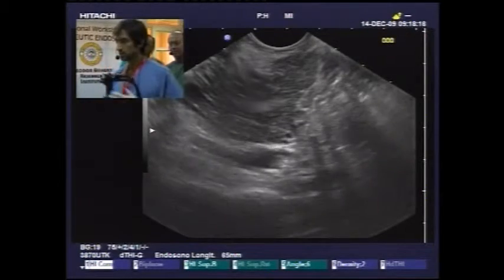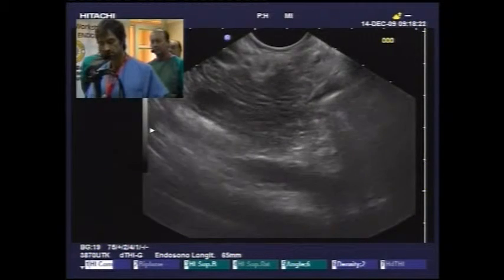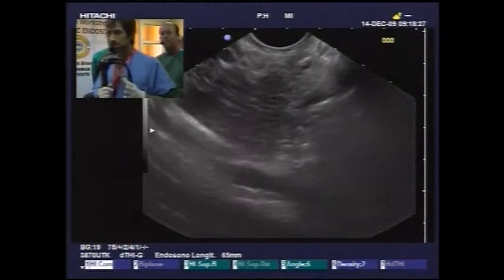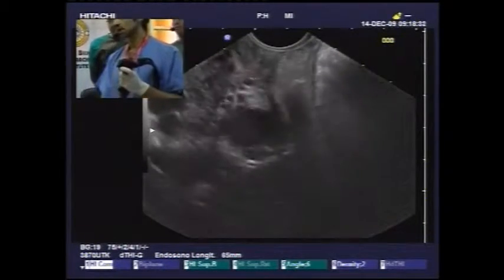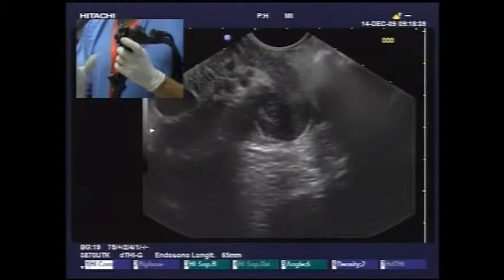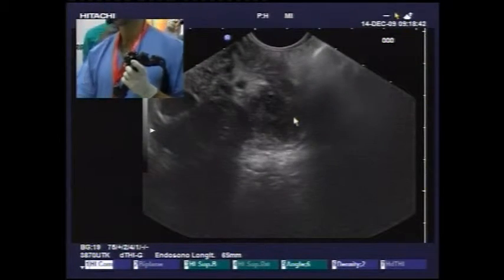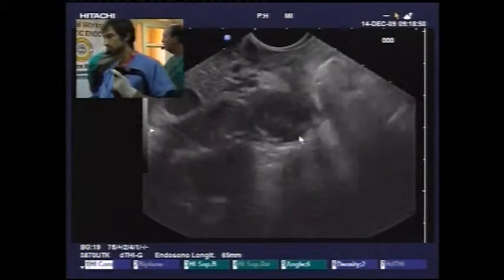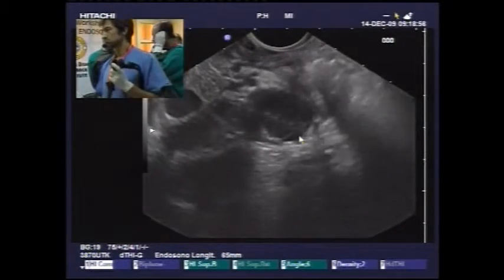Could be TB, but as I already told you yesterday, the lymph nodes in TB usually have an appearance which is clearly different from lymphoma. And how are they different? Because you know that there is caseous necrosis, and the caseous necrosis is bright. So I am expecting a whitish appearance of this lymph node if I am expecting TB inside it. Are there diagnoses local to Egypt that we should be thinking about that we haven't considered?